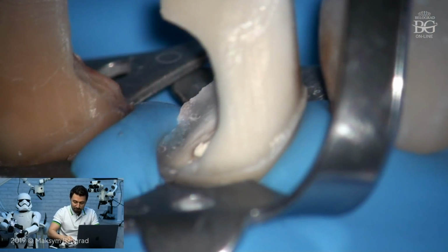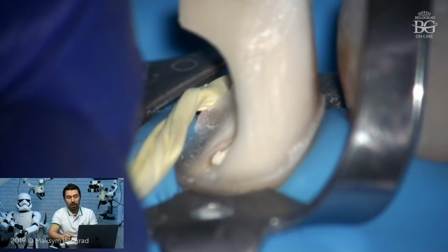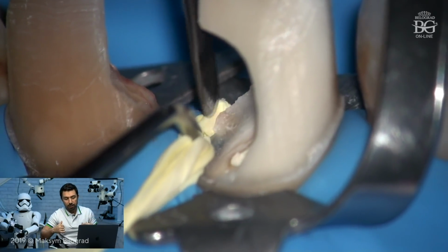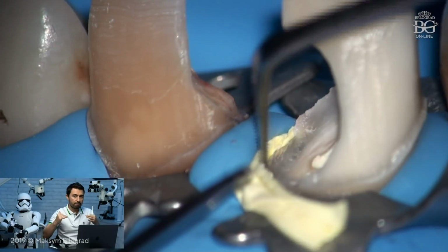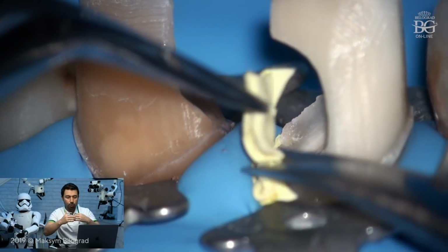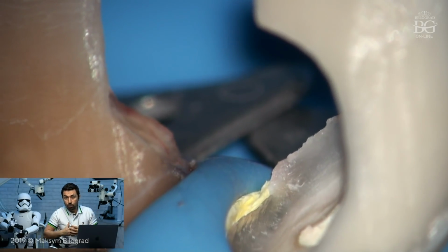Anyways, after we obtained isolation with clamps, we went to another type of isolation, which we call horizontal isolation, because vertical isolation was obtained by the rubber dam itself. We used the heavy rubber dam membrane, and with the clamp we got vertical retraction and vertical isolation. Then we selected Teflon tape to get some horizontal retraction of the rubber dam and soft tissues to expose the margin of the tooth, to see what we are doing, to be able to do a build-up and to get a fit of material in those areas.